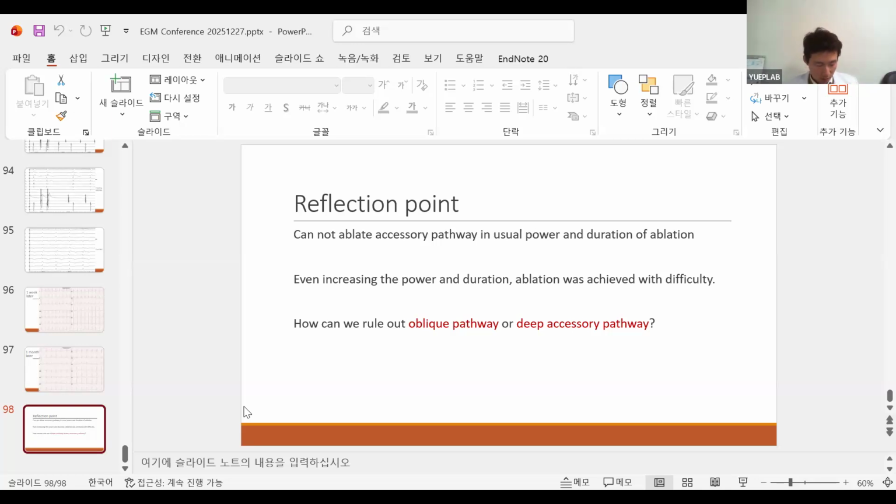I have one experience with epicardial ablation in a right-sided bypass tract. Dr. Eggman recommended mapping the right coronary artery with a microcatheter, but I didn't do that, and I failed. In this case, we delivered too much energy, but luckily that patient had a free wall accessory pathway, and still we could not cut the right-sided free wall accessory pathway. So we entered the epicardial map at the redo procedure, and a high-density 3D map was quite helpful, so we could ablate it with a single burn. But definitely we need to check the right coronary angiogram and compare the ablation catheter position with the coronary artery position.